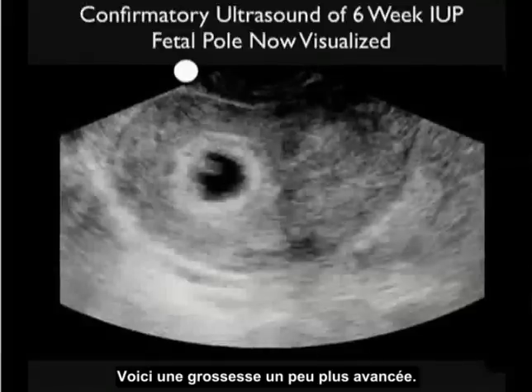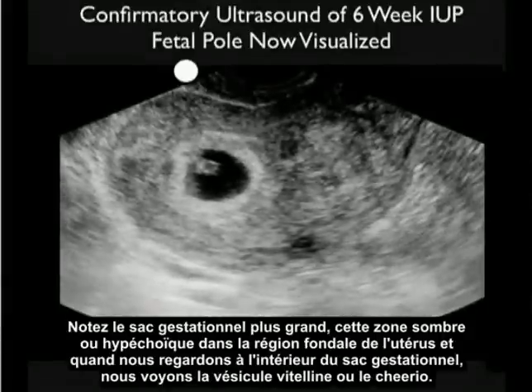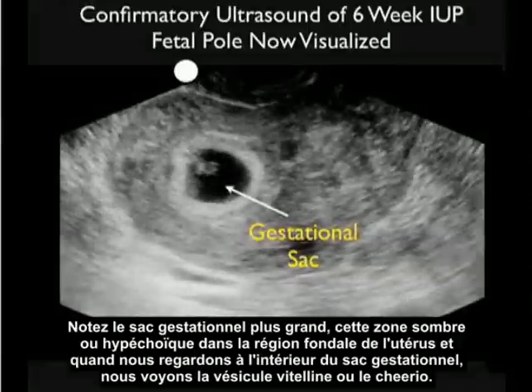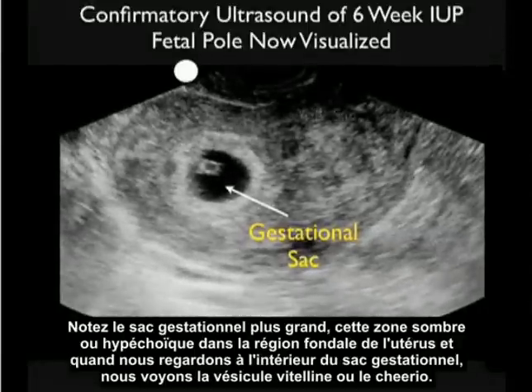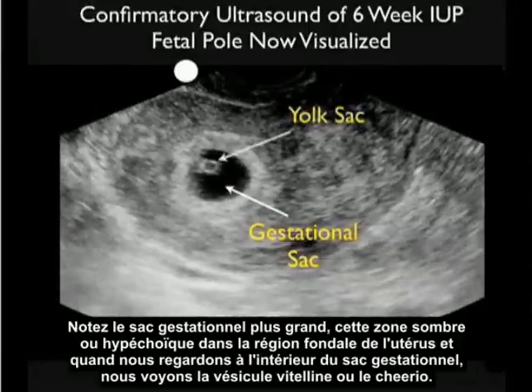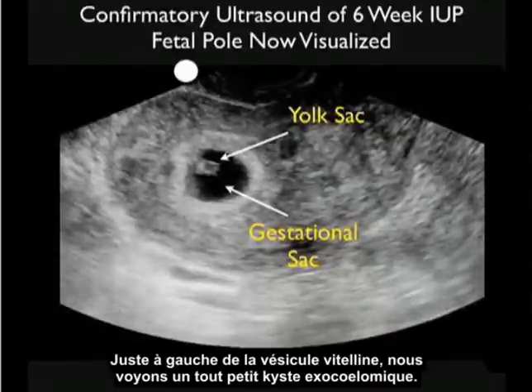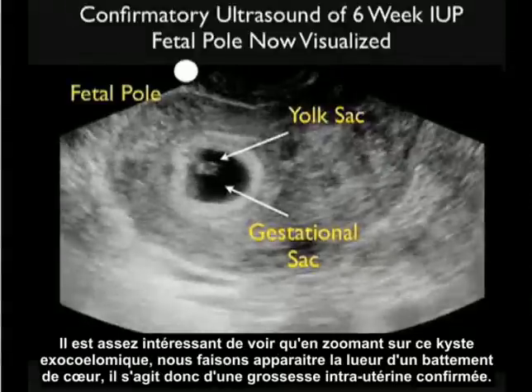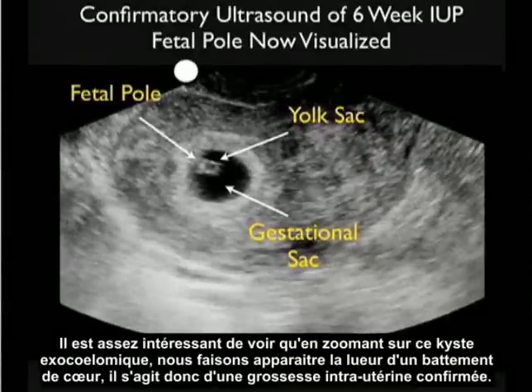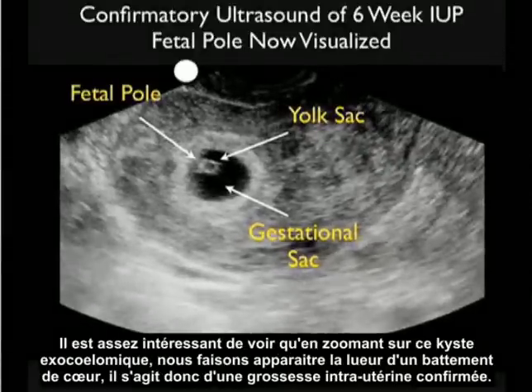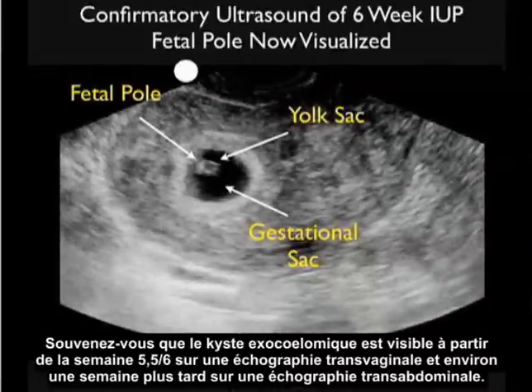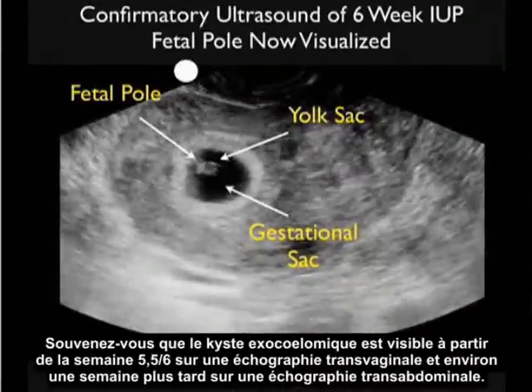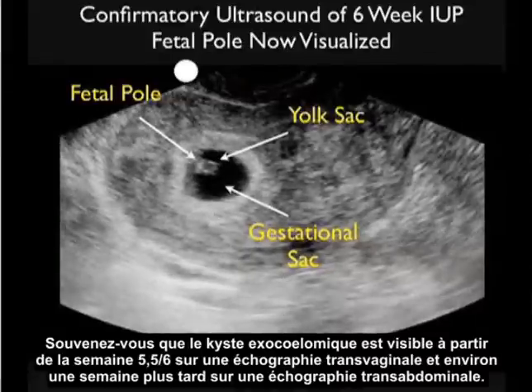Here we see a pregnancy that is a bit further advanced. We have a larger gestational sac — that darker hypoechoic area — within the fundal region of the uterus. Inside the gestational sac we see the positive yolk sac or cheerio, and just to the left of the yolk sac a tiny little fetal pole. As we zoom in on that fetal pole, we can make out the flicker of a heartbeat — a definitive intrauterine pregnancy. The fetal pole is seen at about 5.5 to 6 weeks on transvaginal sonography and about a week later on transabdominal sonography.